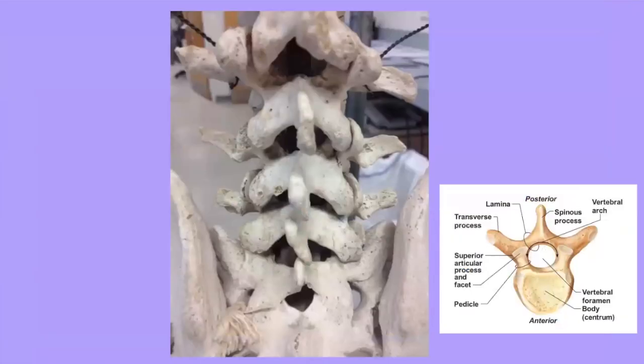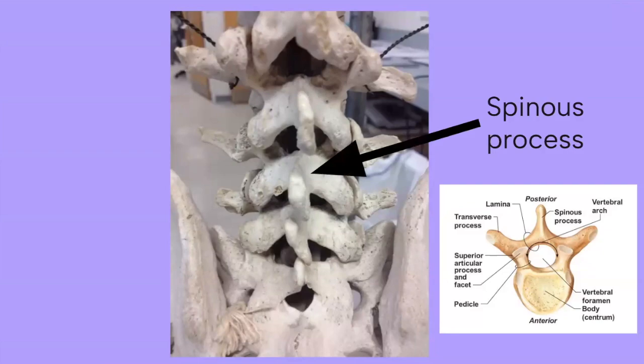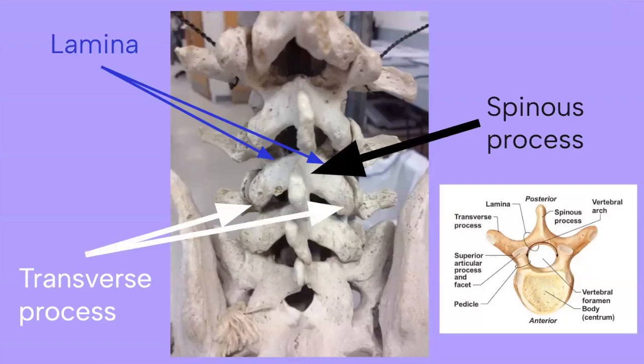This is a spine. As a reminder, there are different parts of the spine. As we will see with our ultrasound, it's helpful to remember the anatomy so that we know what we're looking at with the sono. Specifically, that part that juts out from your spine, the bony ridges, we call those the spinous processes. And that is going to be key to finding where you go with your needle with this procedure. On either side of your spinous process, you're going to see a flat ridge that comes out. That's the lamina. And then on the lateral sides are the transverse processes.